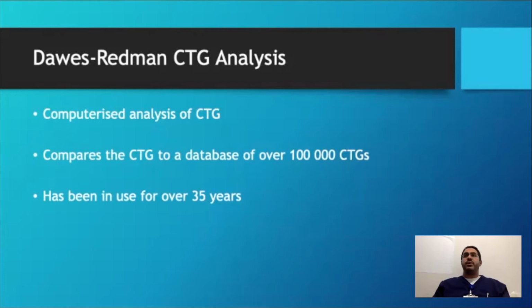It's not comparing babies' responses. It's not designed to look for babies' responses. The only response it's designed to look for is response to movement, possibly. Okay? It doesn't necessarily link the accelerations to the movements and whether this is a sufficient acceleration, etc., as much. Although there is an element where it looks at it, it's not very specific to that.